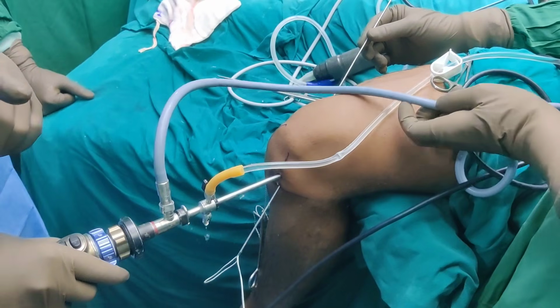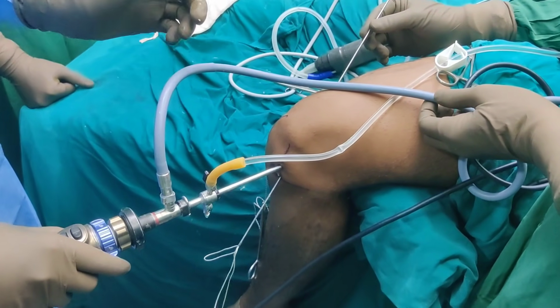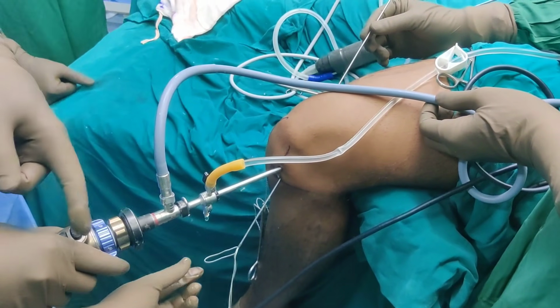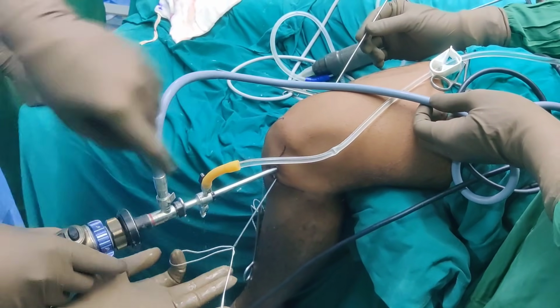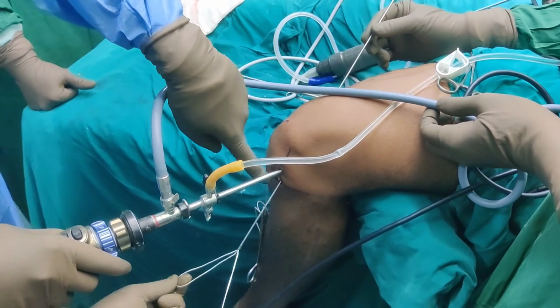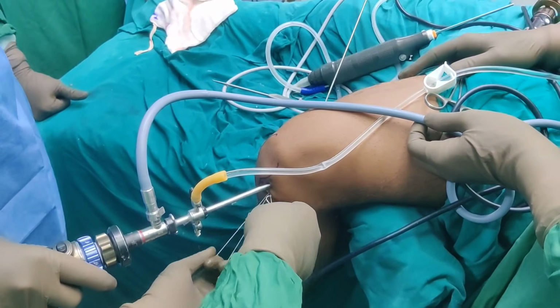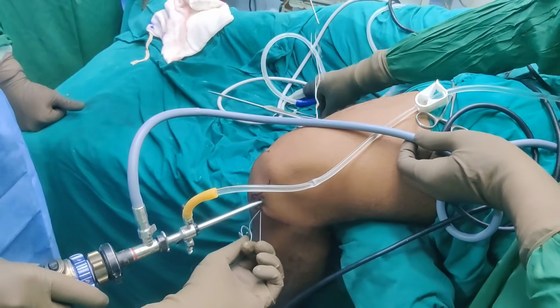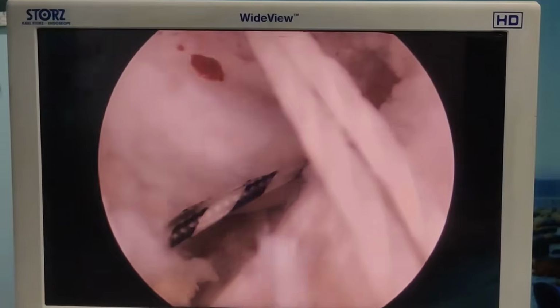Now suture shuttling can be a problem, and you will see a lot of videos, but suture shuttling has not been shown properly. So now this is our first suture shuttling which I have shown. Now this will go from our low and tight anterolateral portal and will come out on the top. So this is one done, but you keep the loop here. Now these are two sutures.